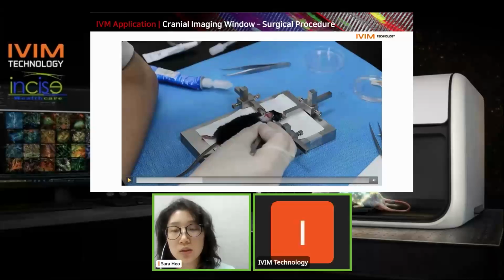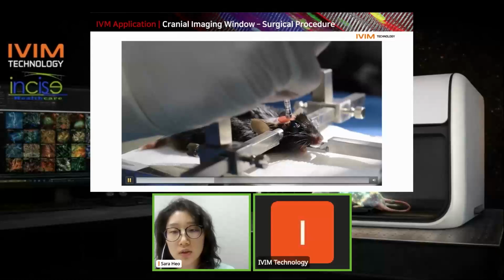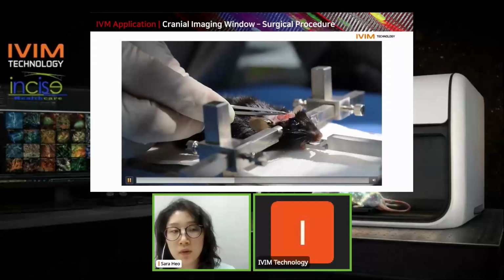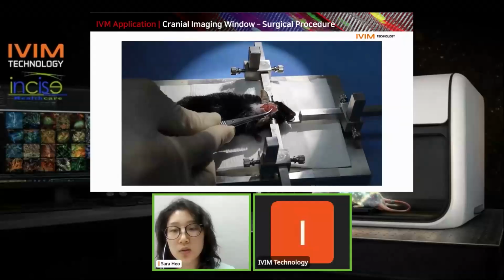Right now, the skull is being scraped by a Meyerhoefer curette to mark the drilling point on the skull. After that scraping, the skull is drilled using the hand drill, right on the top. You have to be careful not to drill too deep or else it will hurt the brain. It's important to drill only the skull. Then the bone flap of the skull is removed using the forceps. And this 3 mm cover glass is going to be used to cover the excised skull area.